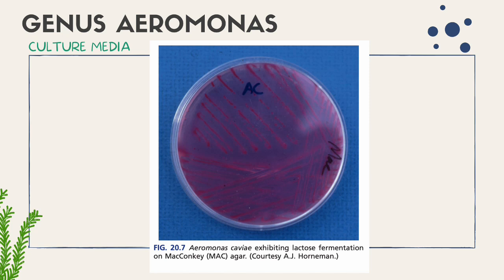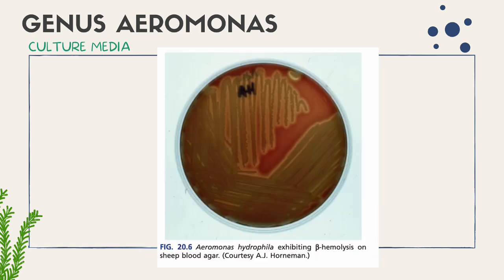So, another example of your Aeromonas caviae exhibiting lactose fermentation on MacConkey agar. Again, they are lactose fermenters, so they exhibit pink colonies on your MacConkey. Here is an Aeromonas hydrophila exhibiting beta hemolysis on your sheep blood agar.